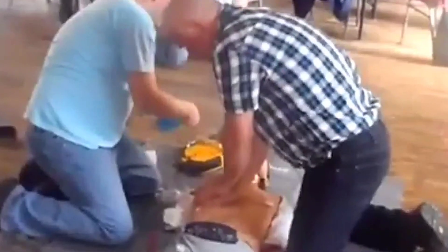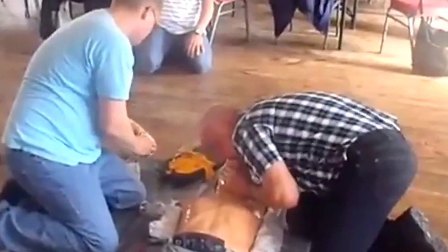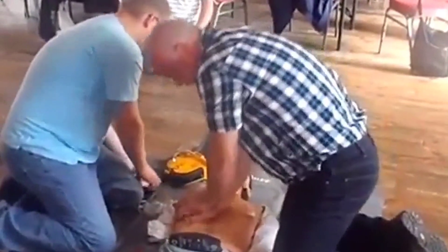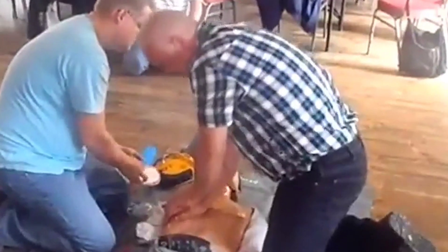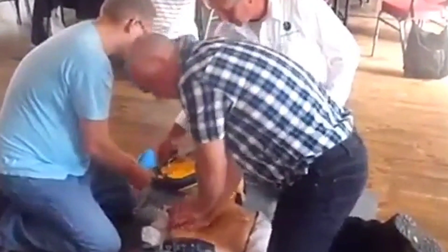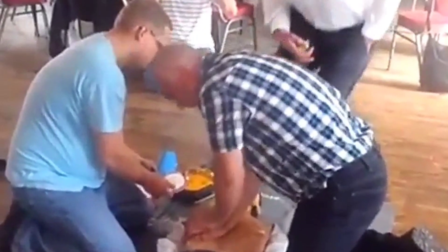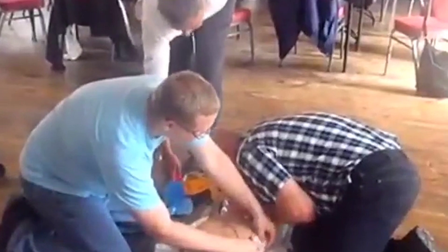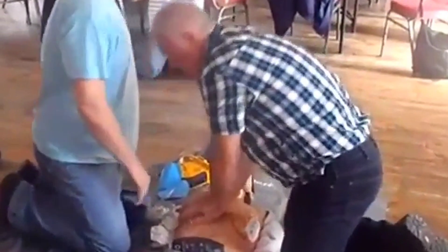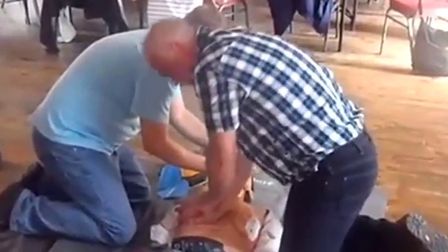I'm giving Mr. Carl two breaths while watching to see his chest rise — each breath takes one second. I'll give artificial respiration twice in this cycle, repeating this heart-lung sequence five times. Effective exposure of the chest is a basic requirement of CPR. Having another person who knows CPR can help reduce your fatigue — you can take turns and will not get tired.